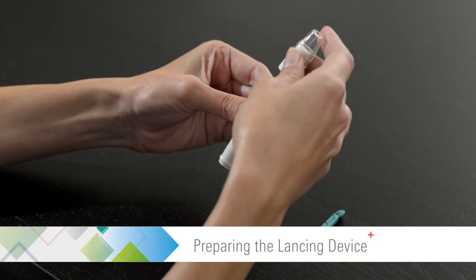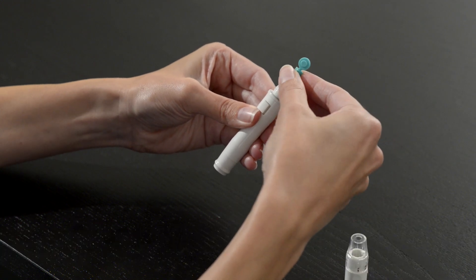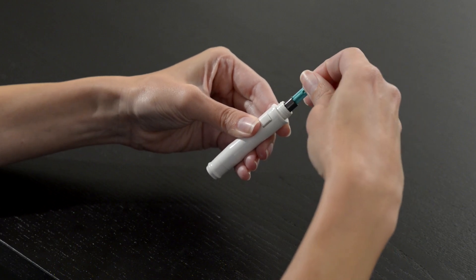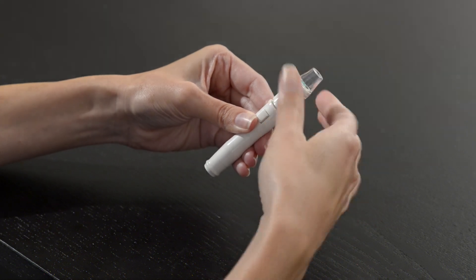Unscrew and remove the adjustable cap and insert a new lancet into the lancing device. Twist off the protective cover of the lancet and set it aside. Screw back on the adjustable cap.